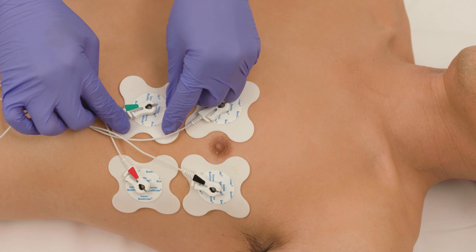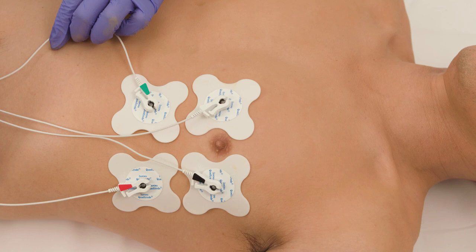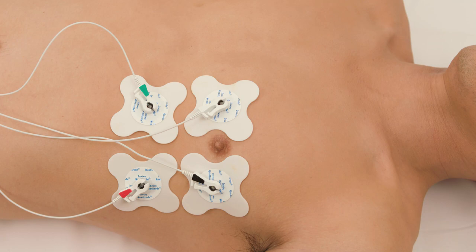All of them will be to the left of the sternum. Do not center them on the chest. If the patient has large breasts, the lower electrodes go under the breast tissue, not over it.